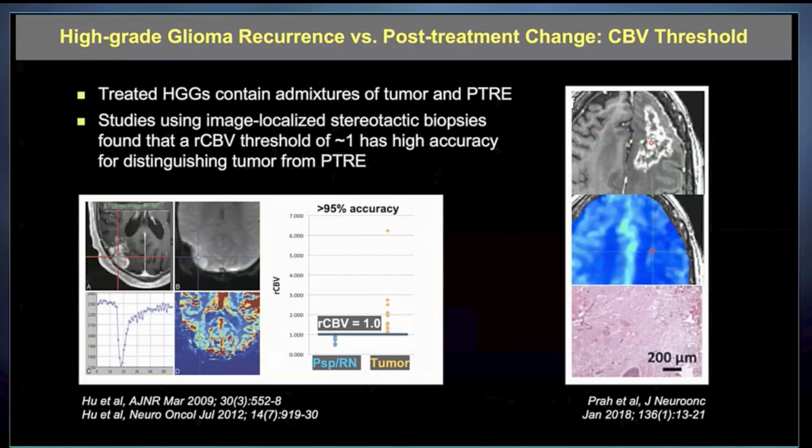They've developed a way of rCBV standardization where you generate equivalent rCBV values to normalized rCBV, but you take away that user dependence, because you don't need to have a person select out areas of normal-appearing white matter. And they replicated the study from our group, which used normalized rCBV, and came up with very similar threshold values using standardized rCBV.